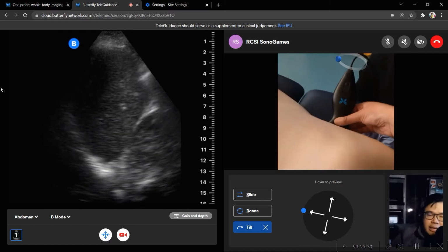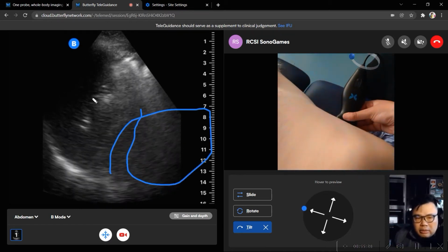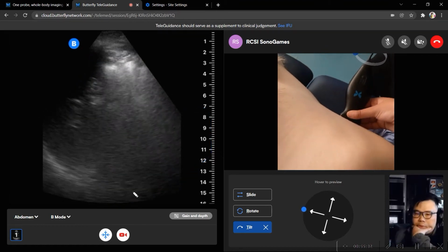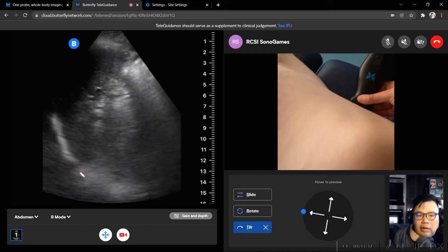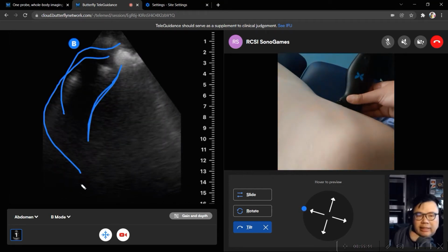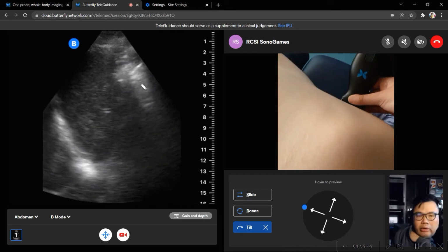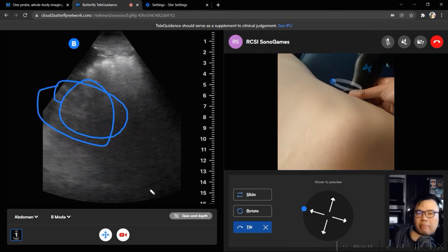But then once you tilt the probe tail up, if you think about your anatomy lessons, your kidneys are retroperitoneal, isn't that right? Yeah. So that's your kidney and your spleen here. So where is the fluid going to appear? Under the diaphragm first. Yeah, perfect. Excellent. This space is very tight, so it's unlikely to be very positive unless somehow the spleen is ruptured in that particular area.